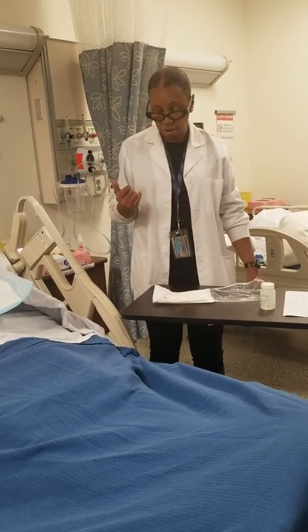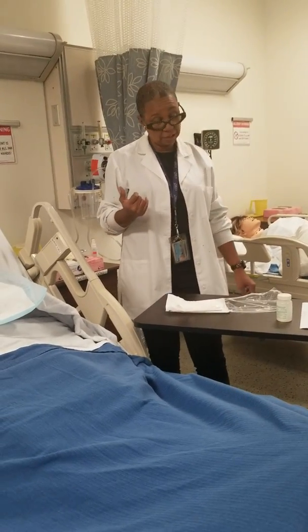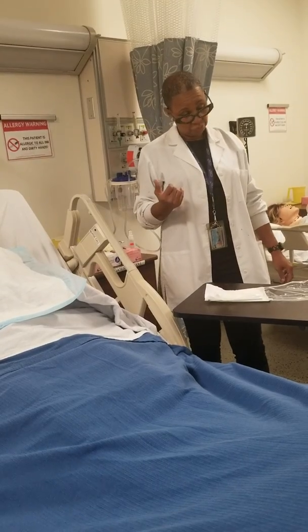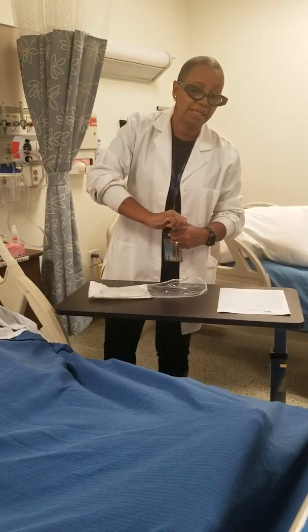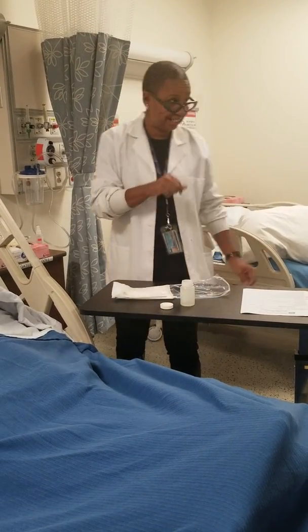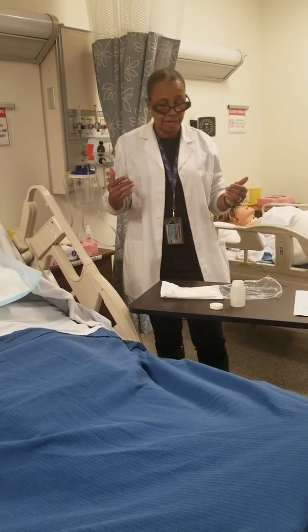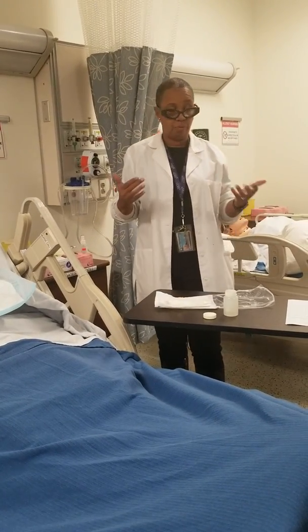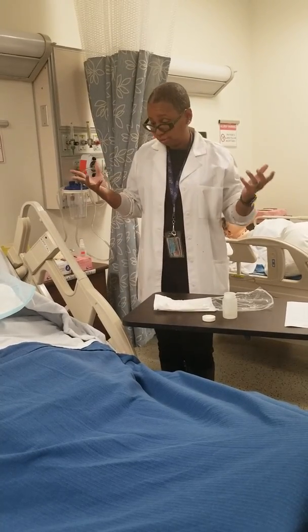So what else do I need to do now? Remove your gloves without touching anything else. Open the lid to your saline. Absolutely, I would open the lid to my saline first so I could get to that. It's a thinking game, so find out what works for you. Once you open it, you're gonna be down to one hand.